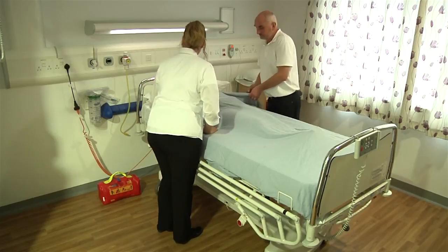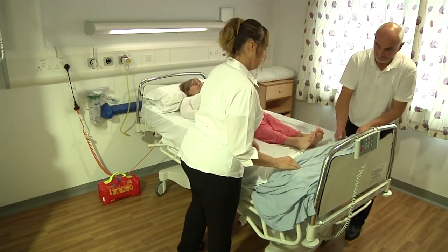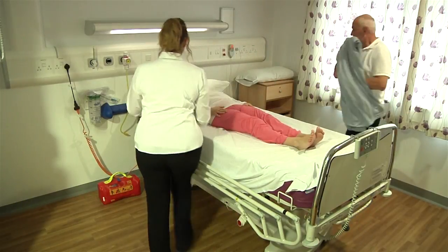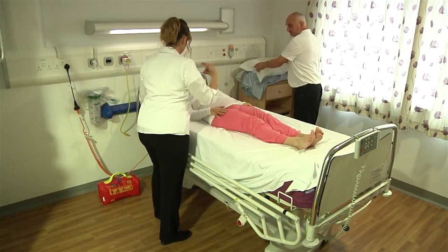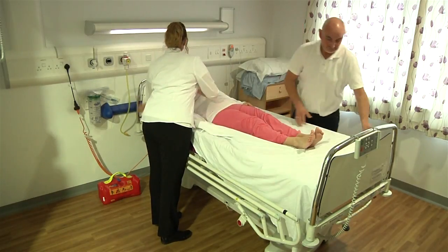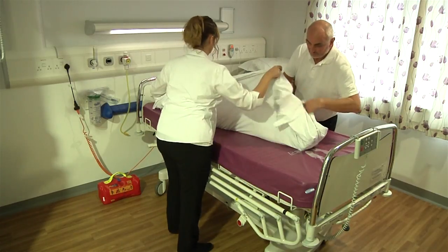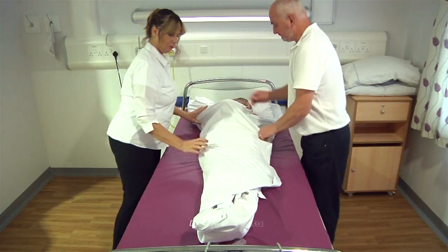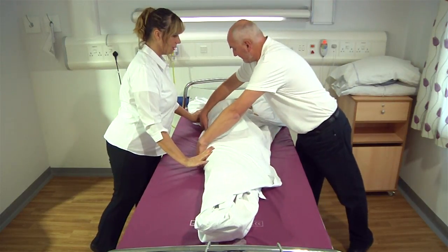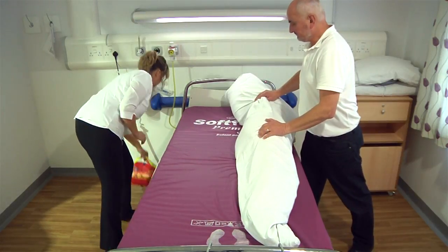When required in an emergency, the AlbacMat can be carried to the patient. If time allows, always work with the bed at a comfortable working height for the carers. Remove the patient's pillows and put to one side ready for use later. To prepare the patient for evacuation, wrap in her bedding. This will ensure that they are kept warm and adds extra protection. Roll her onto her side, ensuring that they are well supported.